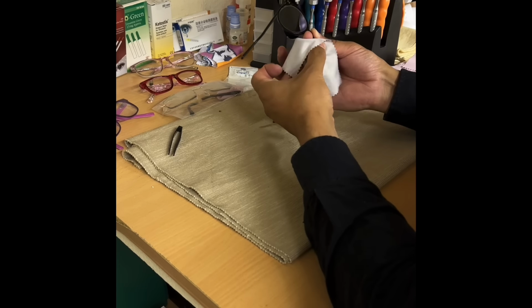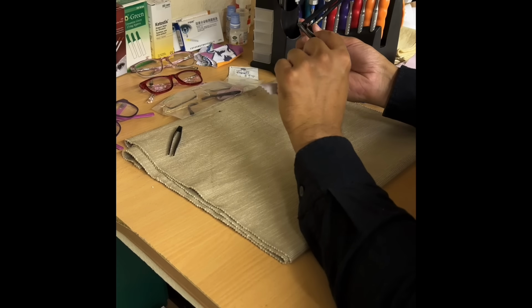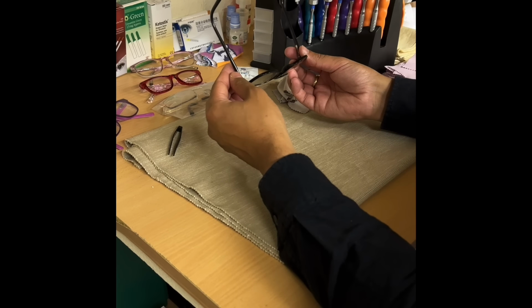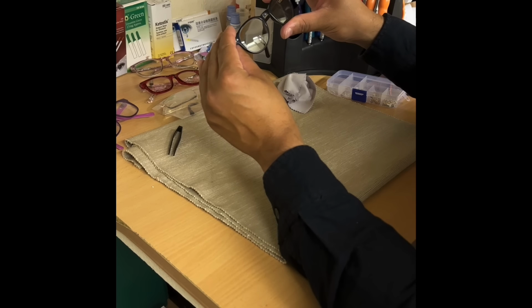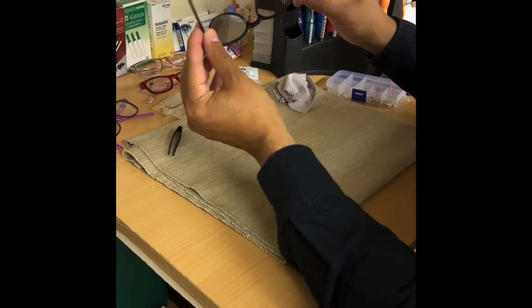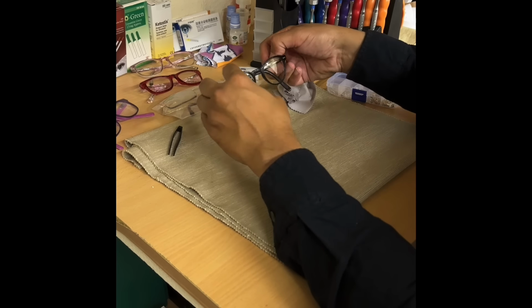Now these may need a trip to the cleaning bath. There's a little bit of deposits there, facial deposits. But that is the best I can do with those. So let me just place them in the lens bath. There's the vibrations to clean just the inner part there, which the lens cloth can't access. Leave that with me.